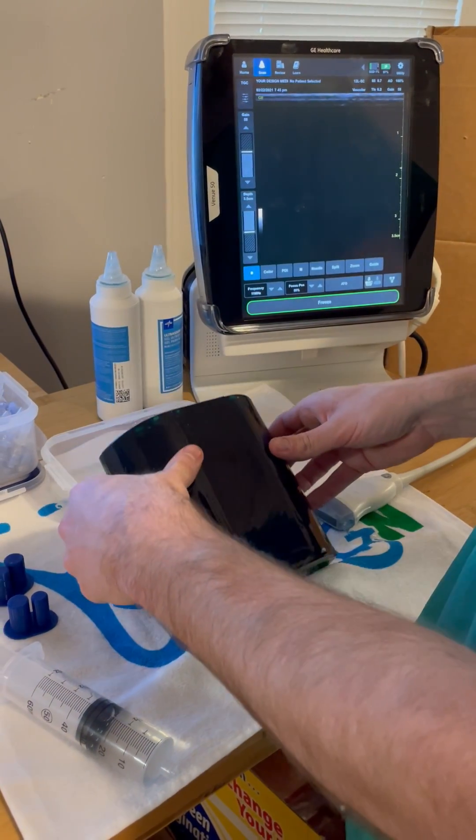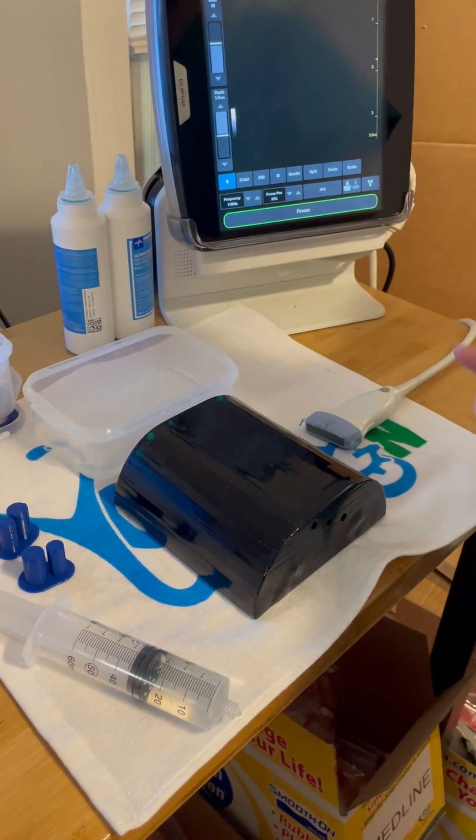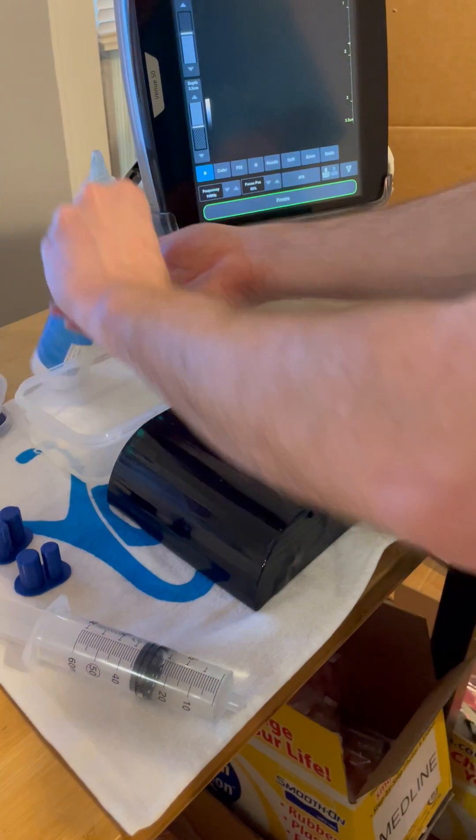You could also prop it up against an object that would help keep the fluid in, but even on a flat surface the majority of the water stays inside the Phantom. Let's take a look.